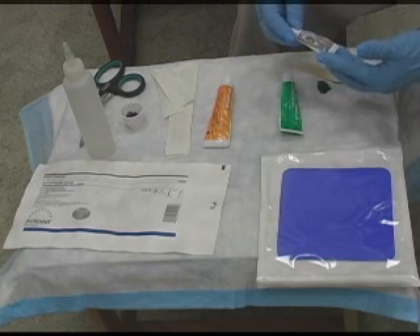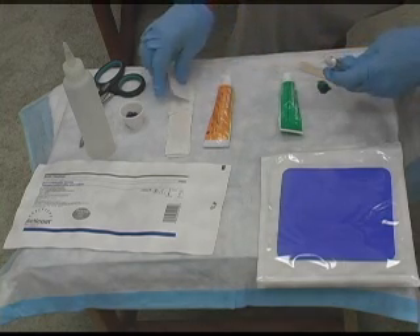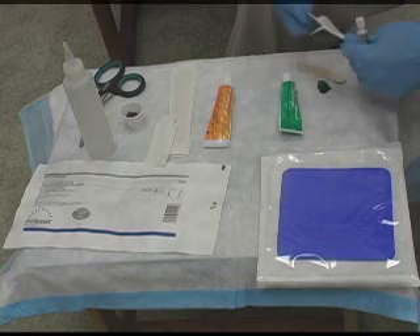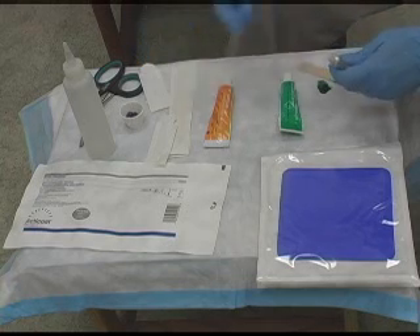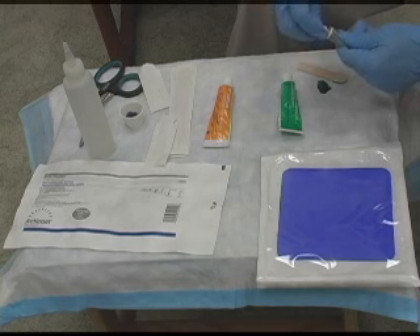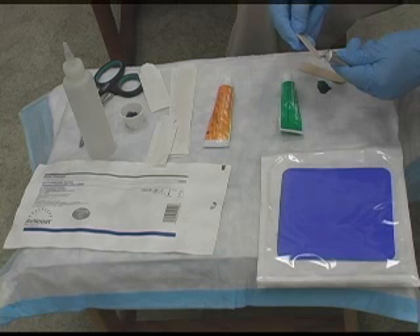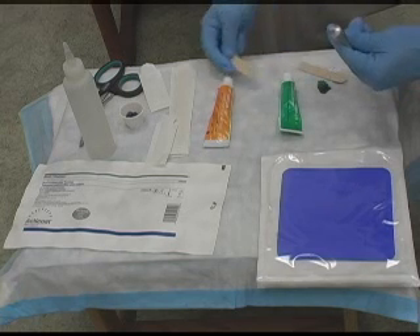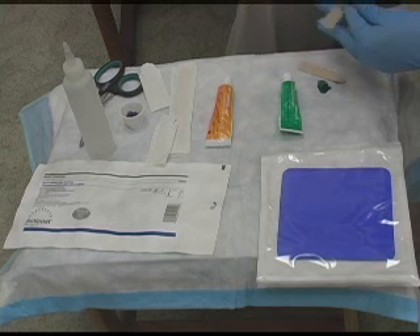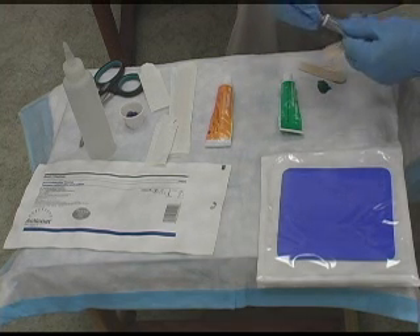The reason you want to make Acuzyme a daily dressing change is because Acuzyme does not distinguish between good tissue or bad tissue. And so it will really debride, but at the same time it will take care of the good tissue also, and we don't want that. With the Acuzyme, you do not want to pack it. All you want to do is apply a film on the wound bed itself, and this one will be a daily dressing change.